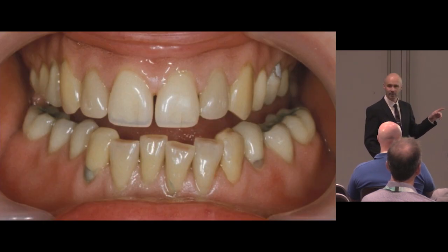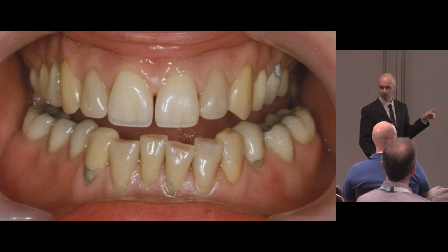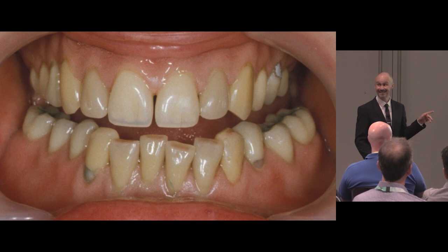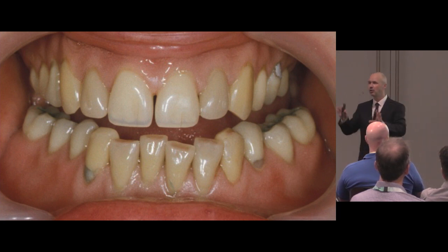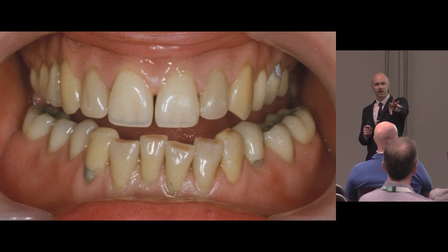prosthodontist. I went on his course about 10 years ago, and he showed me this case. This was the case that really made me think, wow, that's a full denture there, complete upper and lower dentures. He calls this prosthodontic privacy, as in, no one knows that they are false teeth.